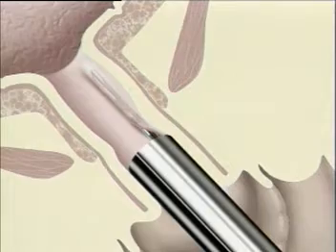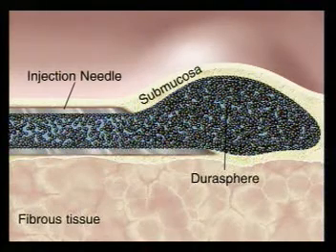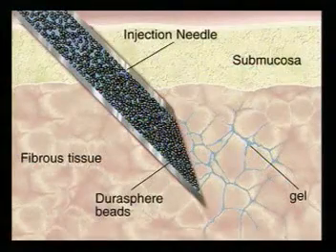Begin injecting Durasphere using consistent, moderate thumb pressure on the plunger. When the needle tip is placed in the proper tissue plane, the material flows readily, creating a tissue bulking effect.